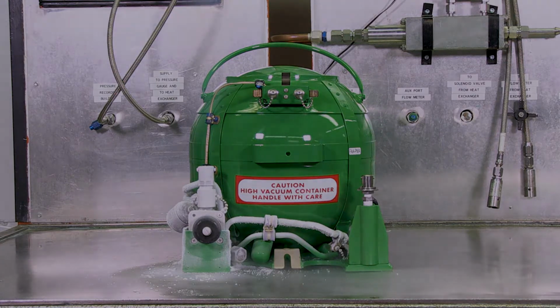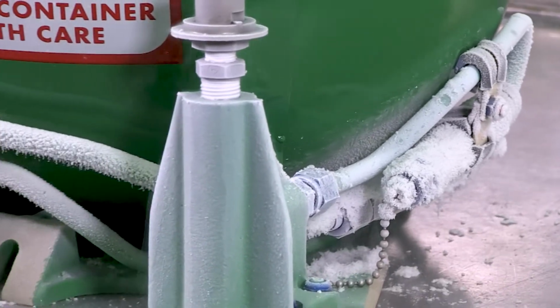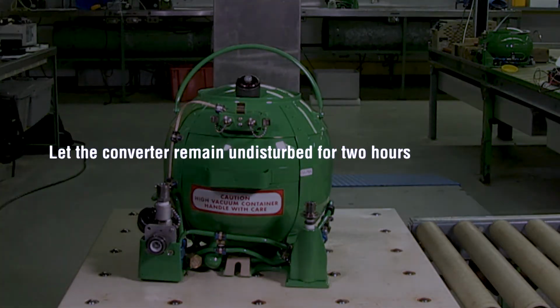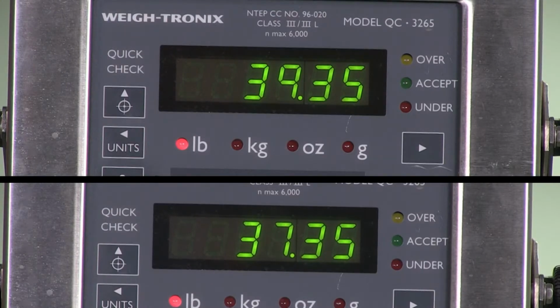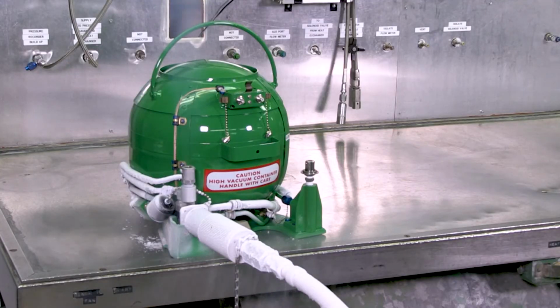If this test is successful, complete a build-up evaporation loss test to evaluate the ability of the unit's valves and plumbing to retain liquid over a 24-hour period. Remove the vent cap to allow the converter to build up pressure. Let the converter remain undisturbed for 2 hours. Repeat the weighing process as performed during the vented evaporation loss test. If this test is unsuccessful, return the unit to Essex. If this test is successful, the unit is functional and can be used.